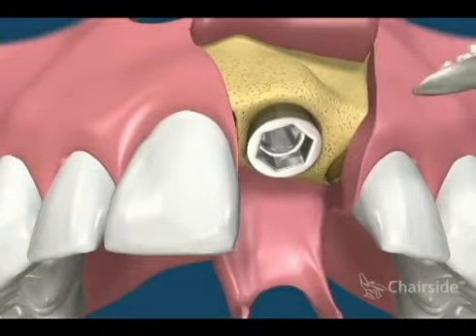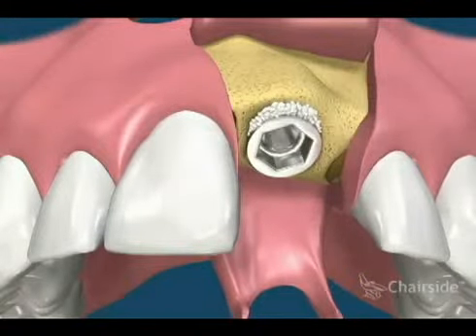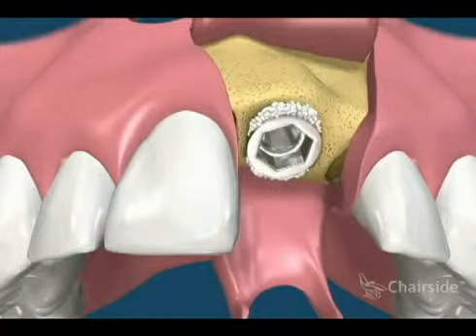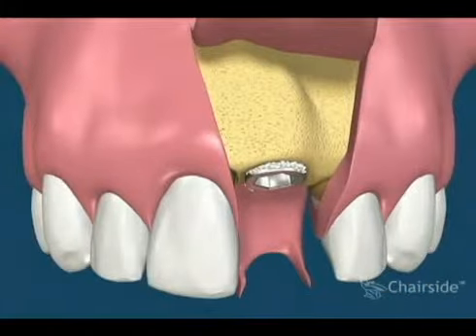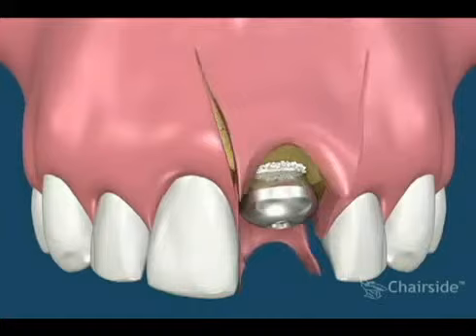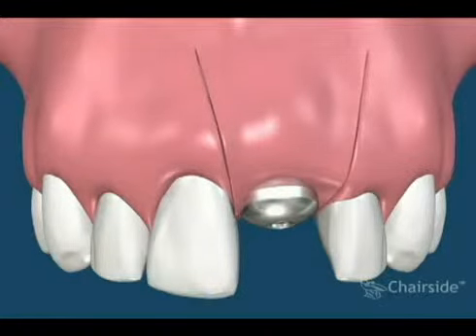Note that there is a small void between the tooth socket and the implant fixture. Bone or bone substitute from various sources can be placed in the void. The implant is covered with a healing cap. The gums are repositioned and sutured into place.